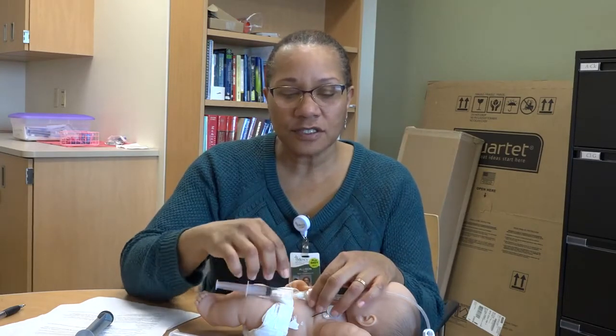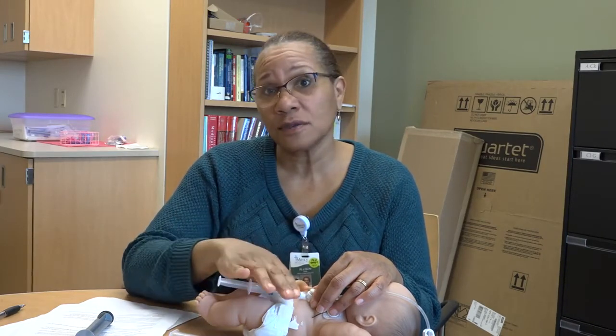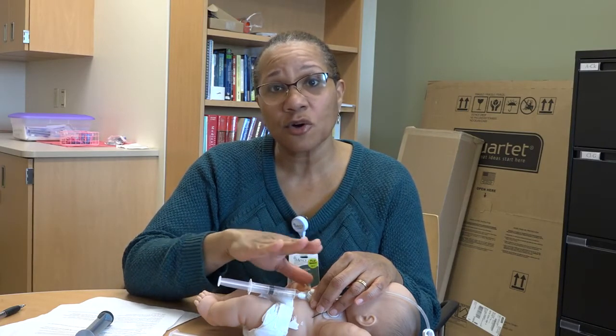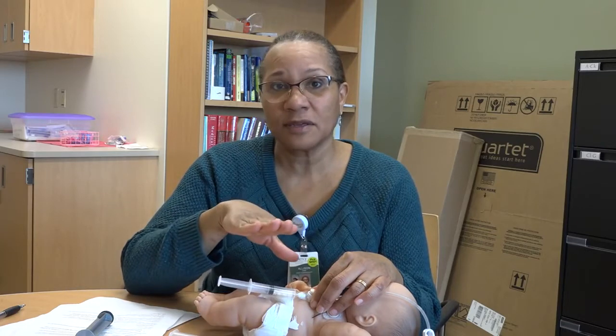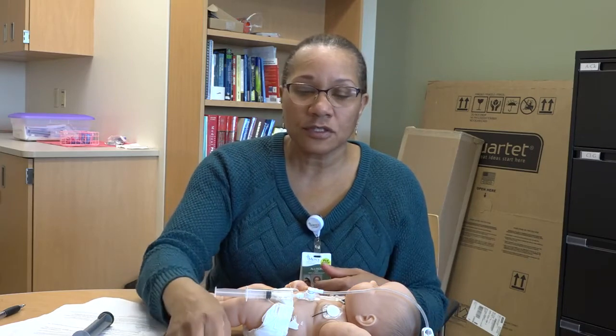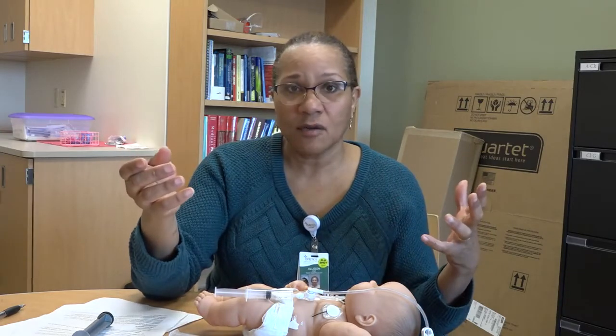If the leakage is such that it is leaking through their clothing, then that is entirely too much leakage, and you need to call the office, the pediatric surgery office, and let us know that you're having an excessive amount of leakage, because that's kind of counterproductive of what we're trying to do. We don't want so much formula leaking out that the baby is losing calories and they're not getting their nutrition. So if there's just a little bit on your tube, on your 2x2, that's fine. If it's so much that it's leaking through their clothing, then we need to know about that.